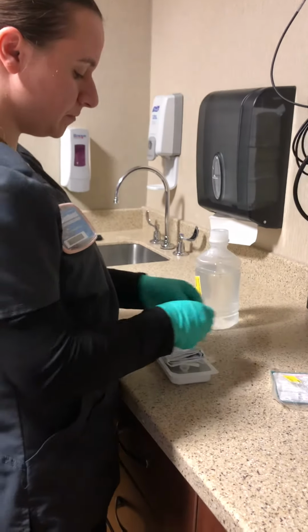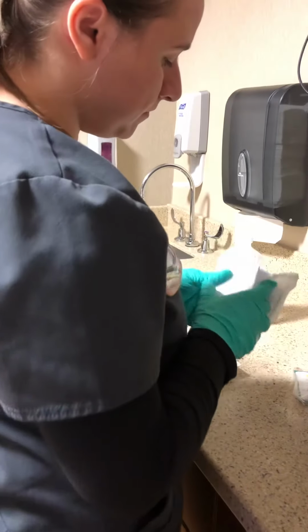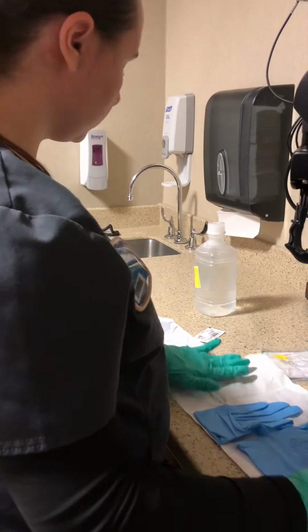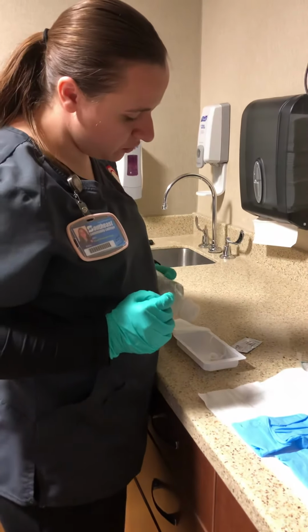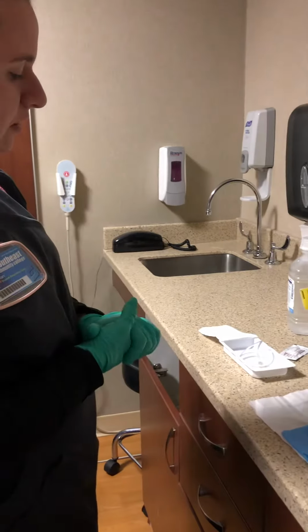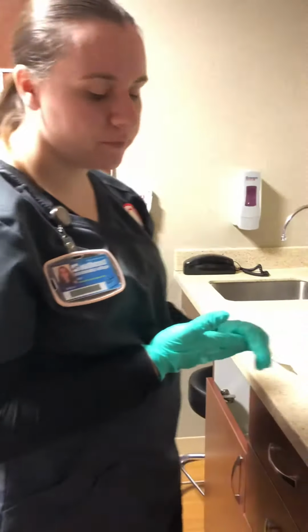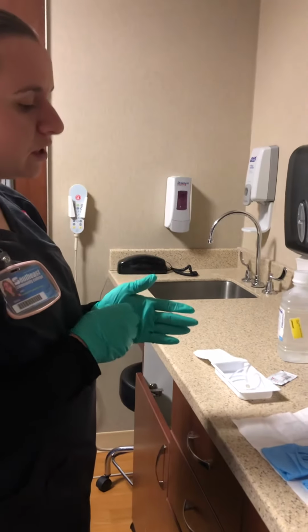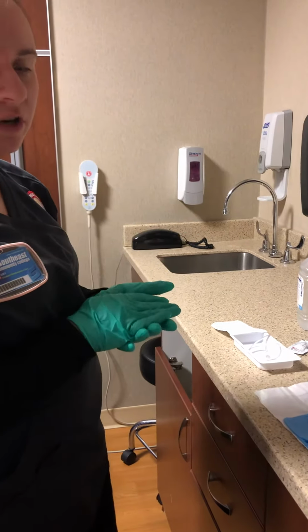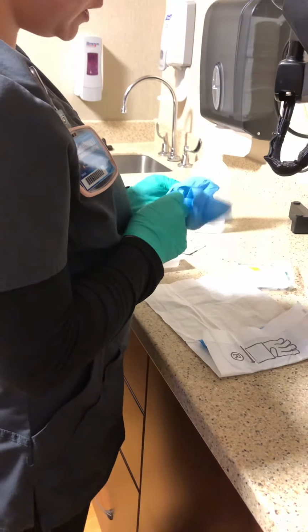And then I will get my kit ready. So I'll place my lubricating jelly on the lid or on clean gauze. I will get my sterile gloves ready. Open that up. Place sterile water into the basin of the catheter tray here. That way it'll rinse the catheter and it's nice and clean for the patient. And then when we're ready, we'll apply our sterile gloves to do the treatment. For the sterile gloves, if you can, try to place them over the gloves. If you can't, then you can remove them, wash your hands, and apply them. So you're always going to want to keep the dominant hand your sterile hand.